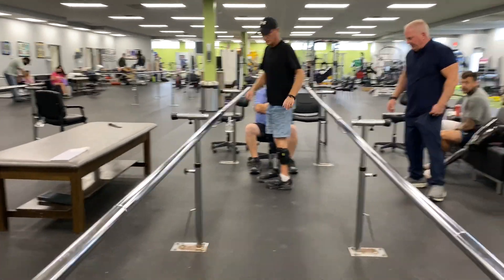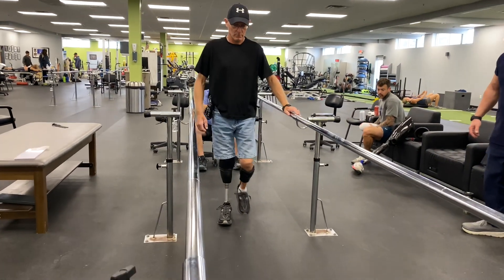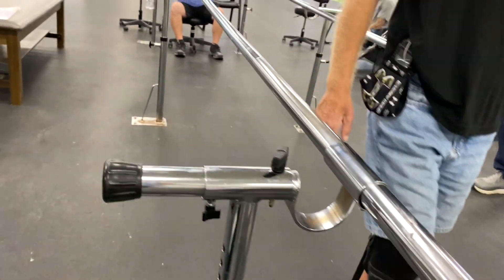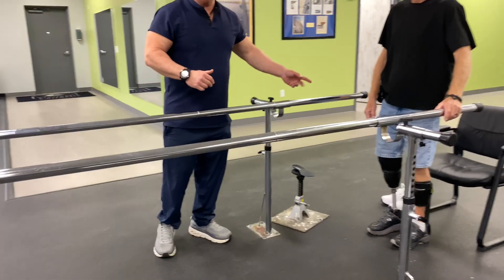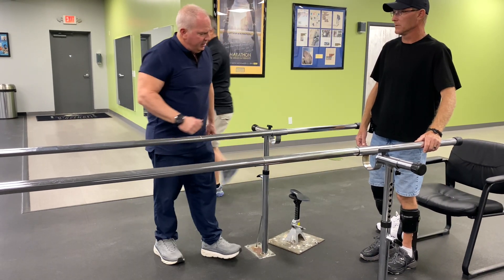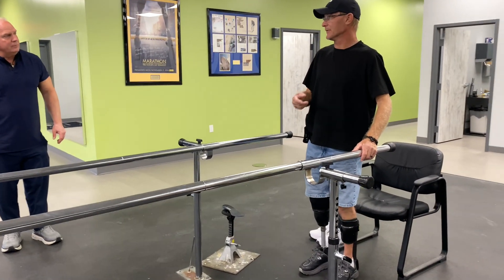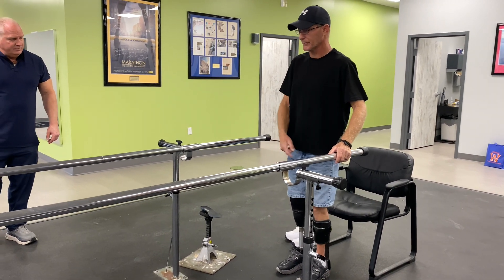Hey Mia, he's on it for the first time — he's got a partial foot and toe drop too, right? So he basically has the same thing. Come over here and watch how he's clearing the ground. I love how you're clearing the ground right now when you take a step. You can see the ankle moving — before, I kept catching an edge every once in a while with this one.